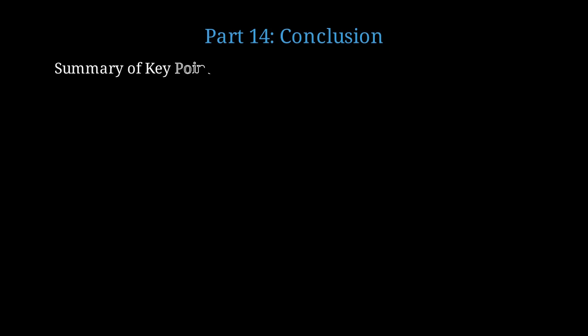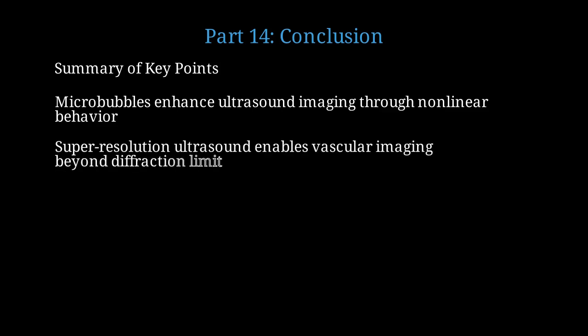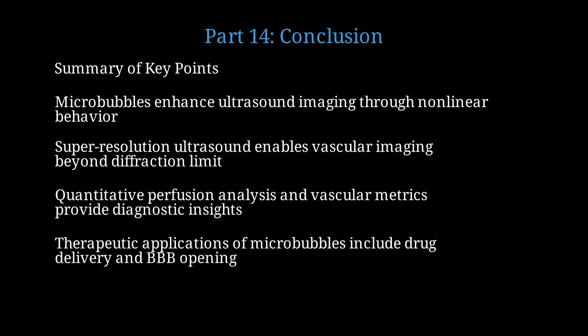Let's summarize the key points from this comprehensive lecture. Microbubbles exhibit non-linear oscillations, generating harmonic frequencies that enhance ultrasound imaging. Super-resolution ultrasound achieves sub-wavelength resolution, enabling detailed maps of microvasculature. Quantitative analysis of perfusion and vascular metrics offers valuable diagnostic information for various diseases. Microbubbles can be used for targeted drug delivery and temporary opening of the blood-brain barrier for therapeutic purposes.